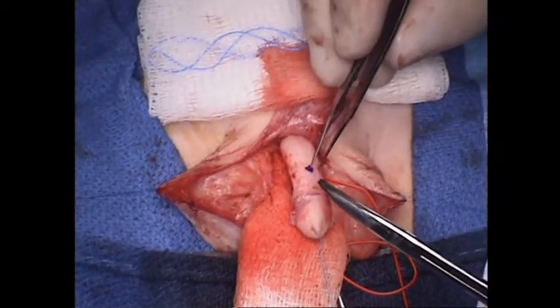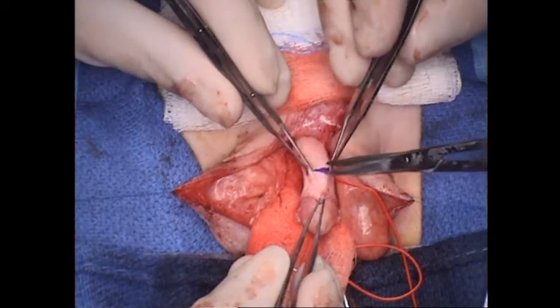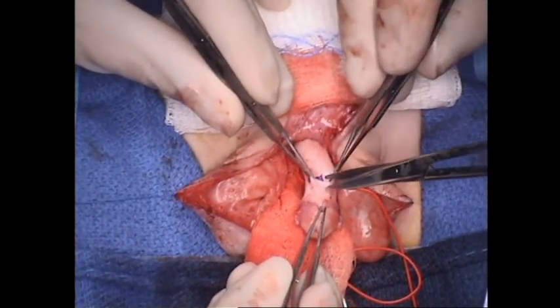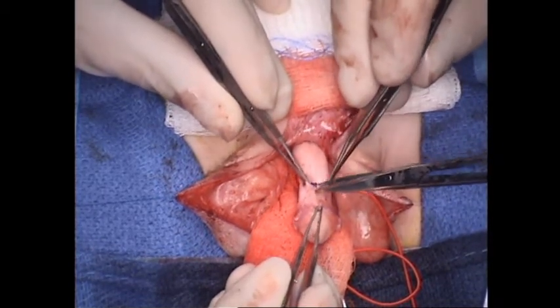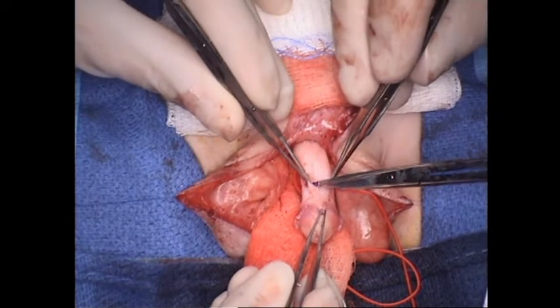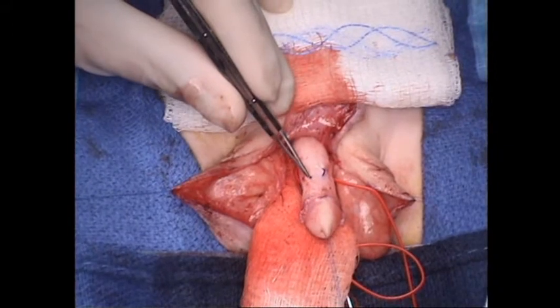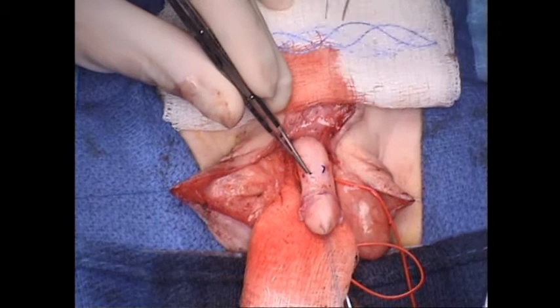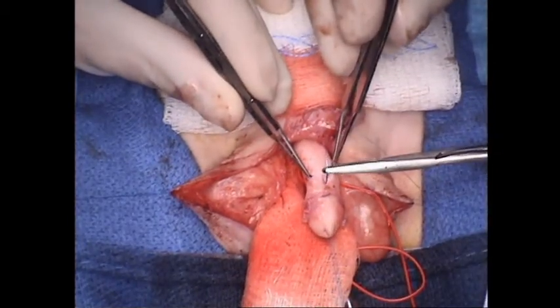Now, again, with this idea of redundancy for the most important steps, backup systems, we're going to go ahead and put a single dorsal plication, not as a major straightening maneuver, but mainly to splint open these corporotomies while things are healing. So we use a 5-0 Prolene. We're going to bury the knot. And this will be our only plication suture.